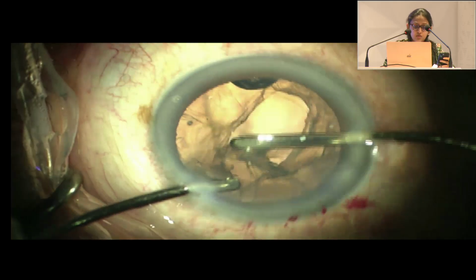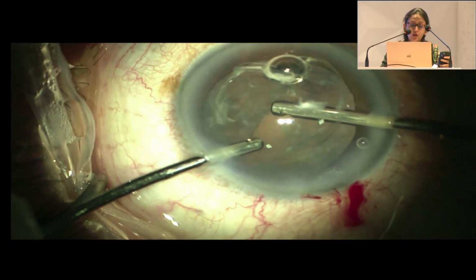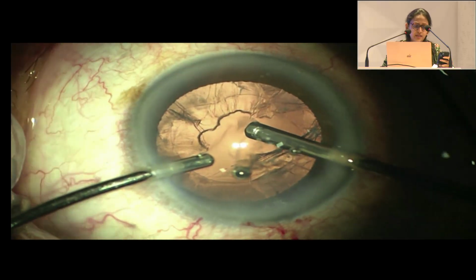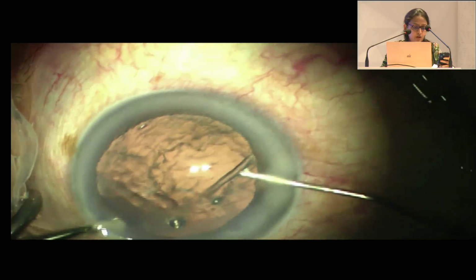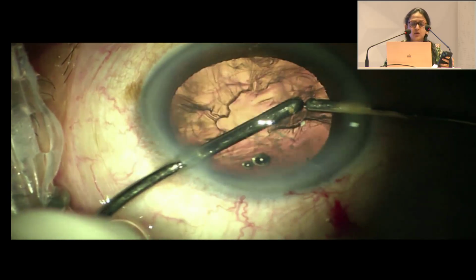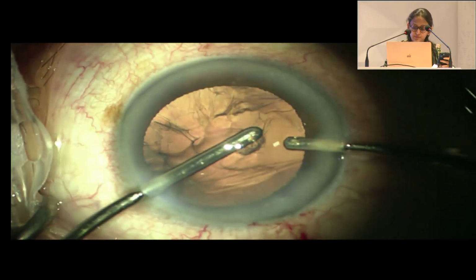So this video again shows similar use of a bimanual I/A and vitrectomy along with triamcinolone after a PC rent, and a 3-piece IOL was implanted after the vitreous was completely cleared from the eye. PC polishing can be avoided due to the fragile nature of the PC, and we can consider Nd:YAG capsulotomy in some patients.